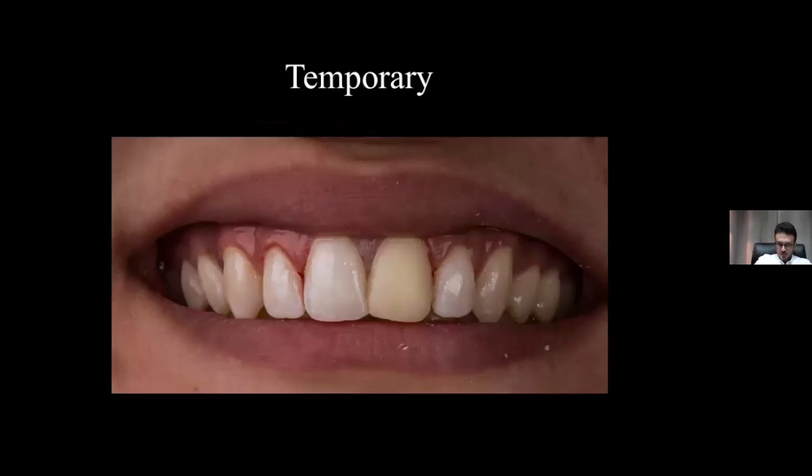Okay, at this stage, what we are used to do is this common procedure, doing it afterwards with a regular impression, or with a CAD-CAM system. You have to, as Dr. Tariq mentioned, make sure that we have the proper outline form and texture.